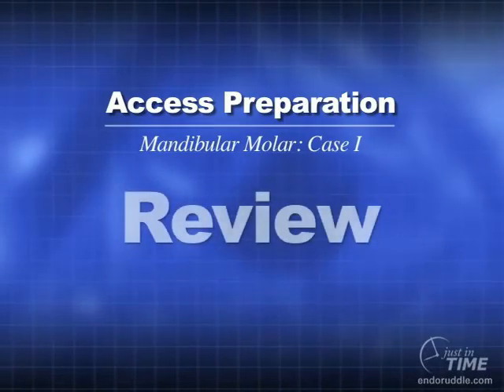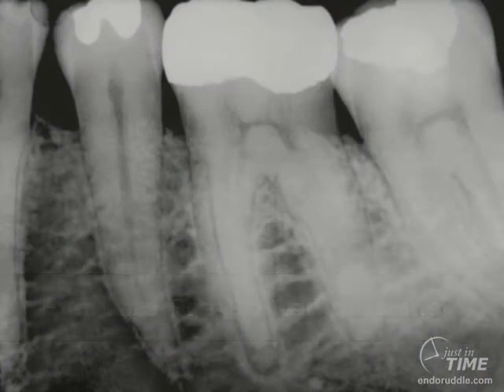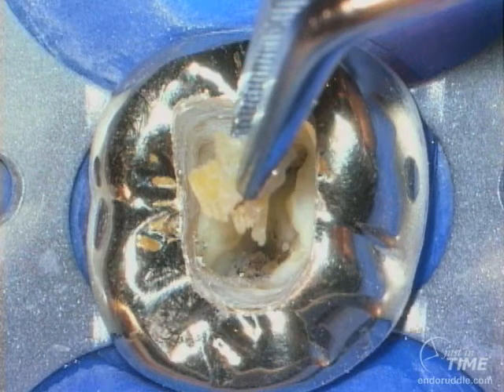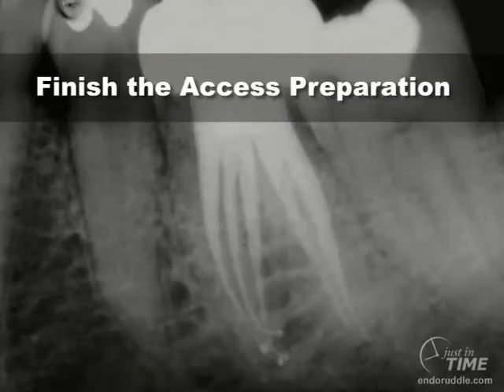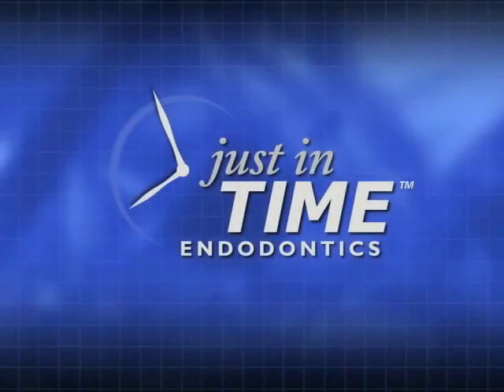Let's review quickly the steps that produce both coronal and radicular access. First, let's initiate well-angulated preoperative films carefully and thoughtfully. We can evaluate the coronal access with the appropriate cutting burr and must progressively work our way down towards the pulpal roof. We can't always fall into pulp chambers, so let's be aware of calcification. Calcifications can be removed either by resection or ultrasound procedures. Establishing radicular access is critical to good cleaning, shaping, disinfection, and obturation methods to follow. Great access allows us to visualize and find all the orifices. We can look for straight-line access by evaluating our postoperative films to see if our axial walls are smooth and flat. Finishing the access cavity is the sine qua non of excellence.